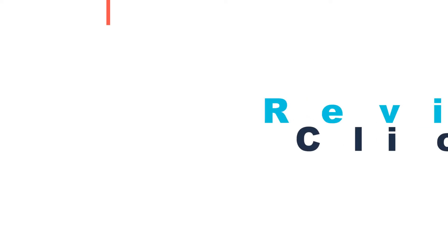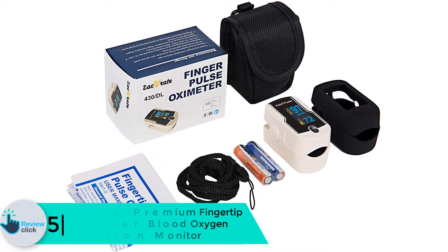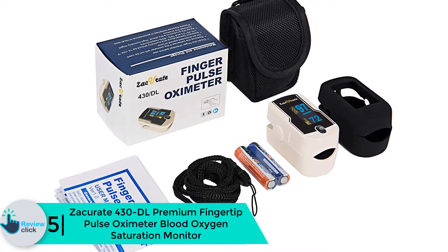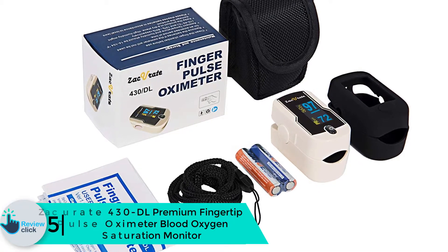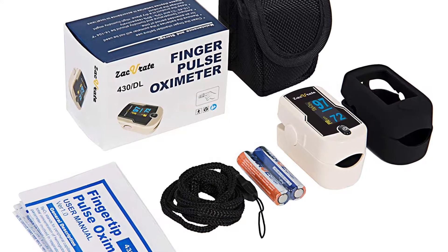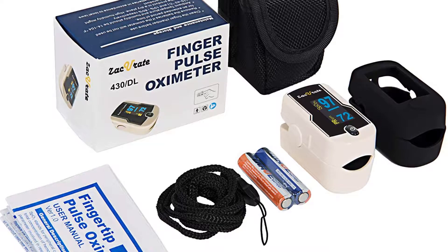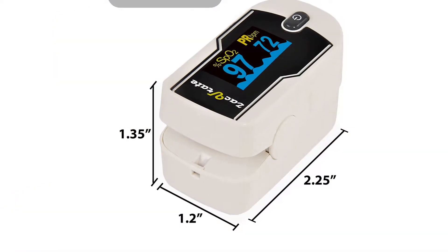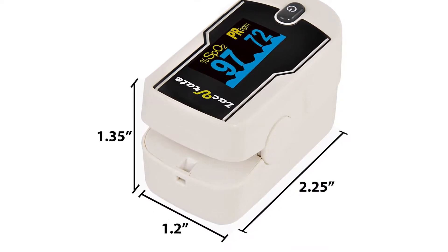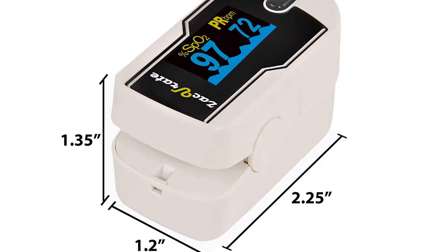Starting at number 5, we have the Zaccurate 430 DL Premium Fingertip Pulse Oximeter Blood Oxygen Saturation Monitor. The Zaccurate oximeter is one of the top performing devices that enables everyone to determine blood oxygen level easily. The device is simple to use since it's designed for the fingertip, meaning you can use it anywhere, especially for extreme activities like mountaineering and hiking.